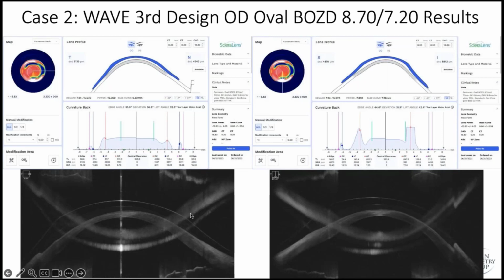And as far as the lens, I've essentially achieved what I think is at least good enough, if not as good as it'll get. I've got clearance, my optics look aligned, and I got rid of the midday fogging. If I look at that vertical meridian, the lens does not touch, but it aligns a little bit tighter, so I don't have nearly as much space there. So this is certainly the best I feel I'm going to get, or that I want to get.